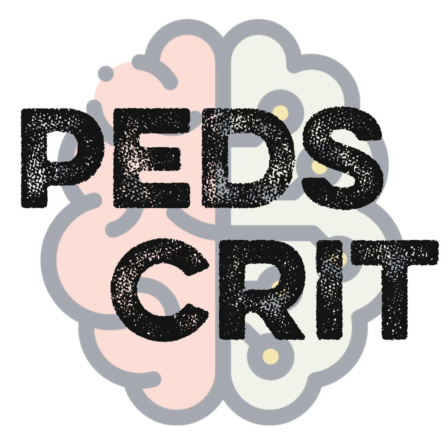All right. So to bring it back to our case, we've got our 17-year-old now on APRV. She's on a T high of 6 seconds, a T low of 0.5 seconds, a P high of 28, and a P low of 5. It's been maybe 2-3 hours since you put her on these settings, and you're still having trouble getting the FiO2 below 80 to 90%. How are you thinking about adjusting the settings to improve her oxygenation?